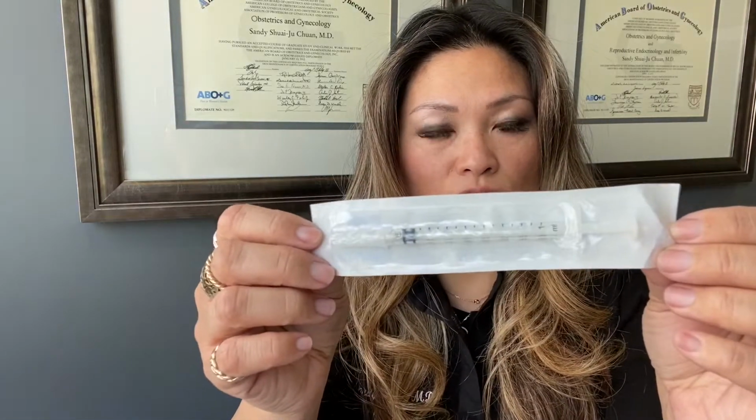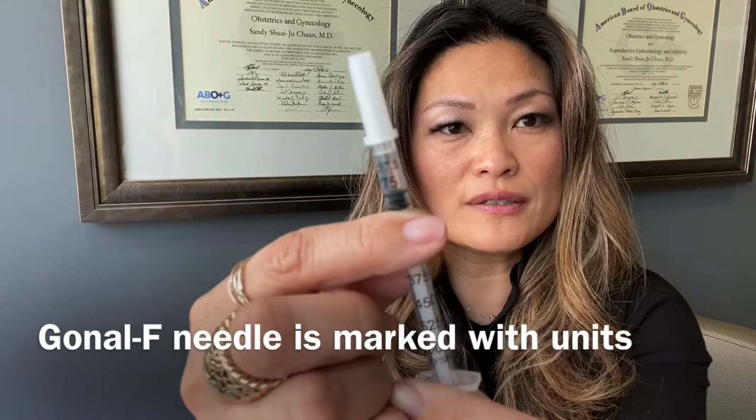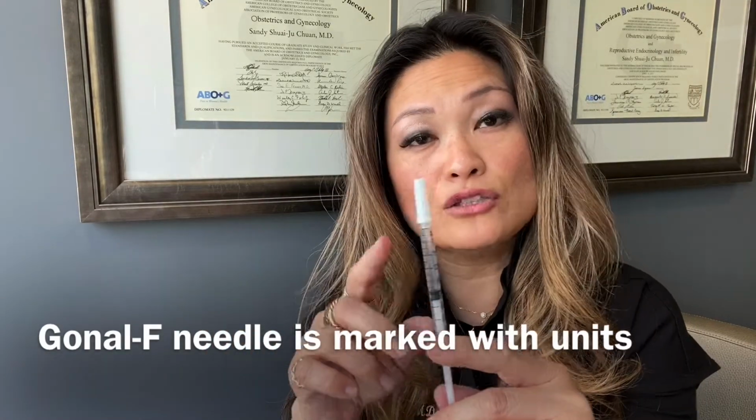So usually when you get a syringe and a needle, it's usually by volume. So it has markings on it that tell you, for example, on that 3 ml syringe, it had a 0.5 ml marking, 1 ml, 1.5, and 2 ml. Well, this needle is special because of the markings on it. I don't know if you can see that. Here you go, you can see 150, 225, there's a 75 up there. 75, 150, 225, 300, it's actually matching to the amount of units you'll be using.